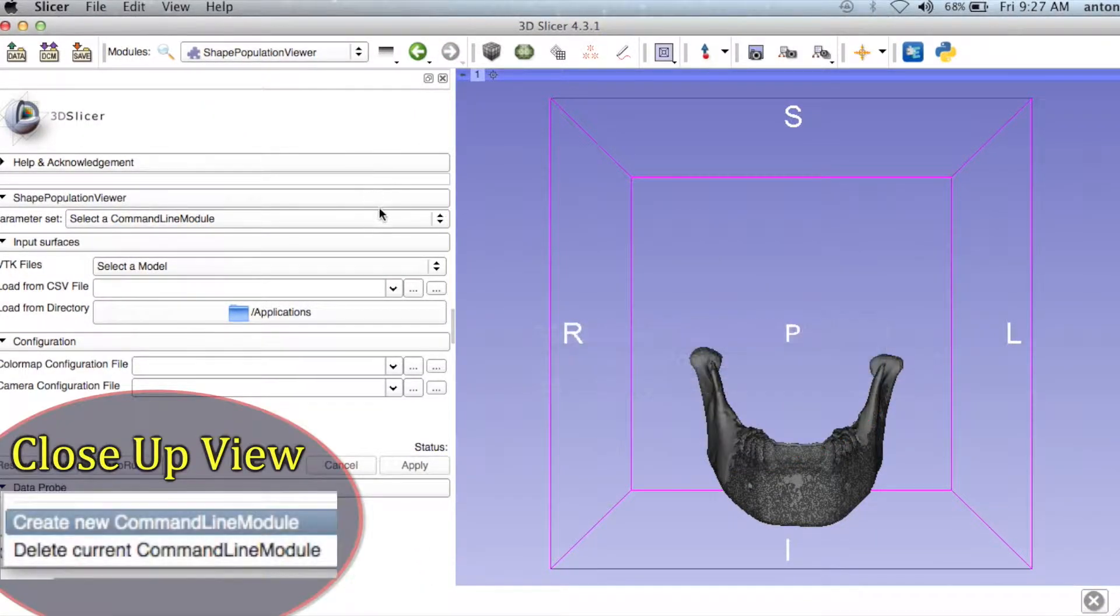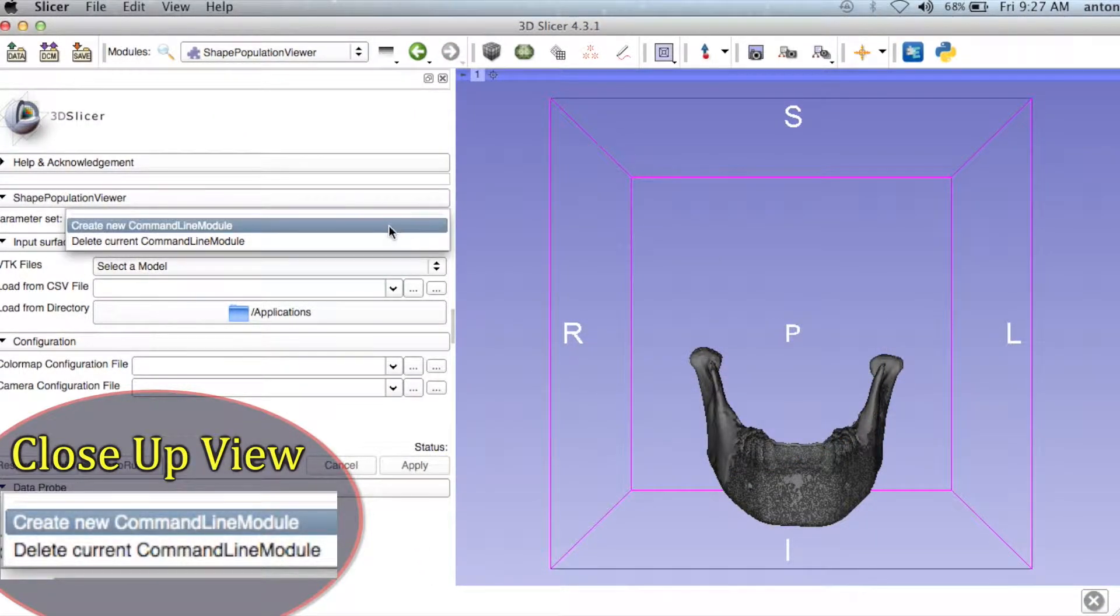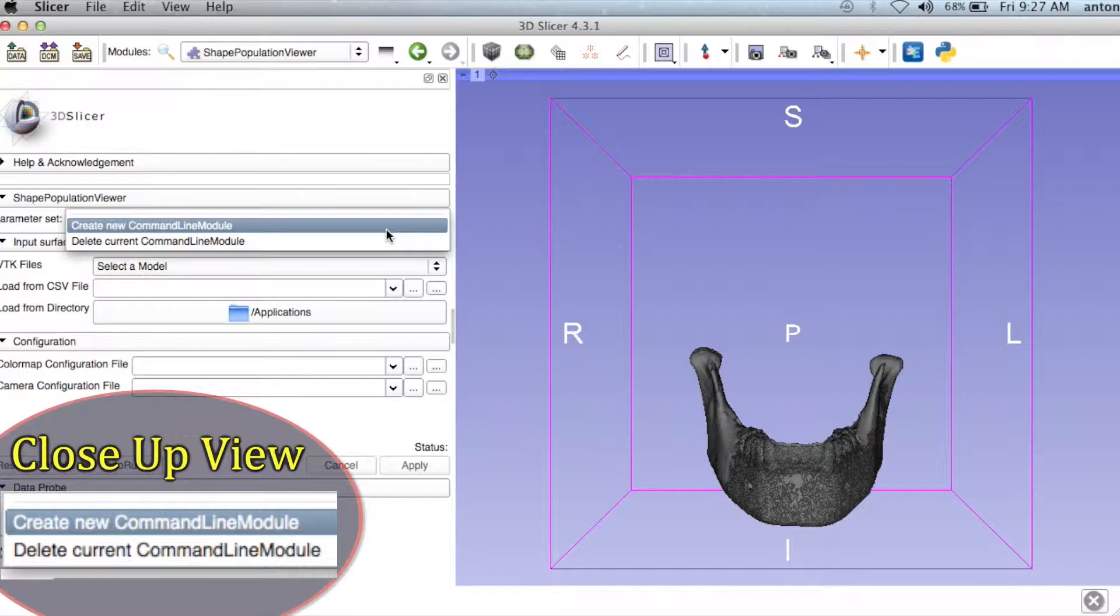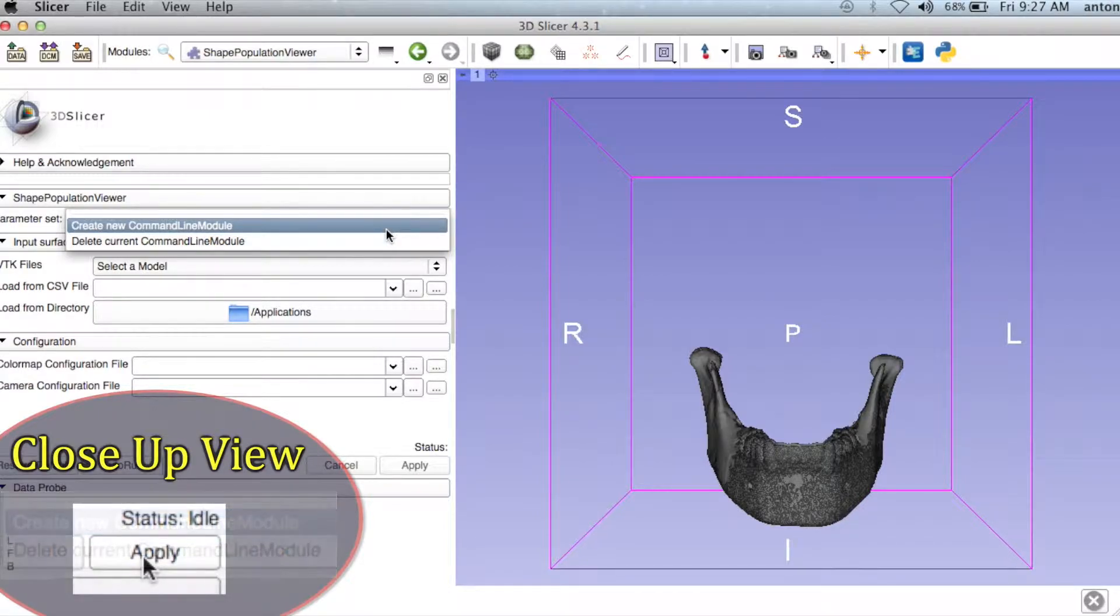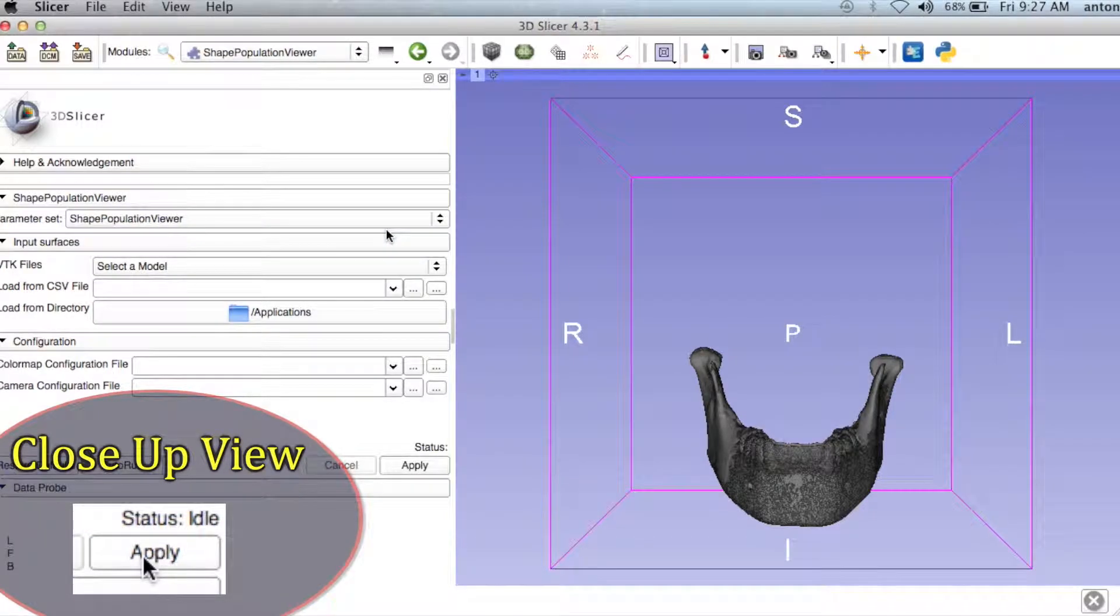For the parameter under Shape Population Viewer, click Create New Command Line Module, and then click Apply.